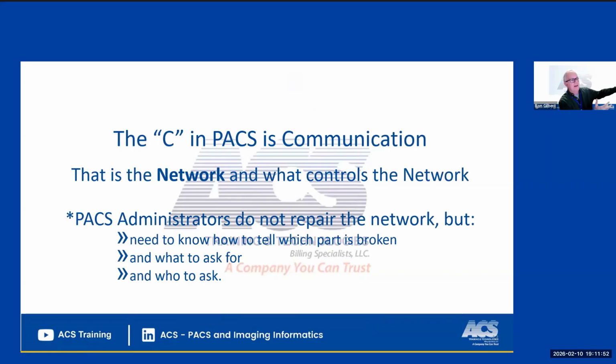Is it the wide area network that the radiologists are using when they're reading at home? Is it the Citrix system that is running, a server-based system that they're getting access to? Or is it the standalone workstations? Or is it the local network that is in the building? Or is it something else? Maybe it could be Wi-Fi. Maybe it could be all that.